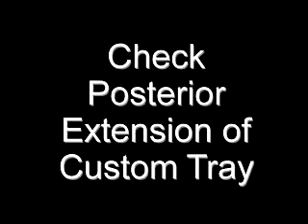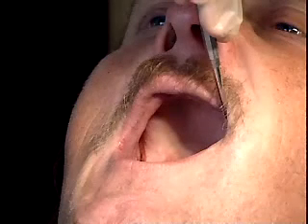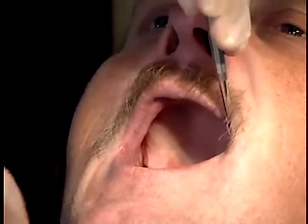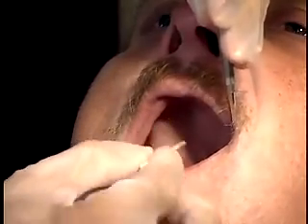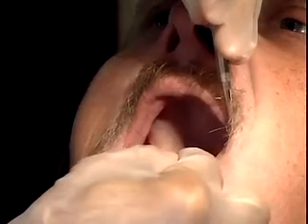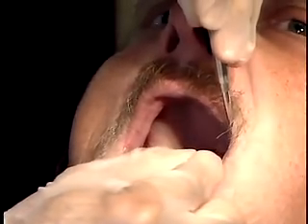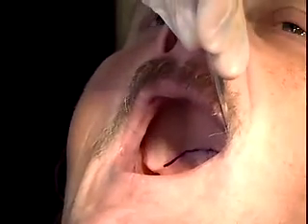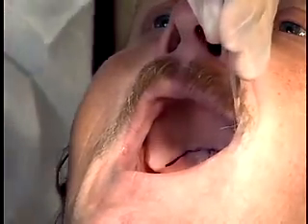Gently dry the tissues in the posterior palatal seal area and pterygomaxillary notch with a gauze sponge. Locate the pterygomaxillary hamular notches. Mark the notches with an indelible marker. Locate the vibrating line by having the patient say a series of short ahs, and mark it in the mouth with an indelible marker. Mark the area of the soft palate where movement just begins.